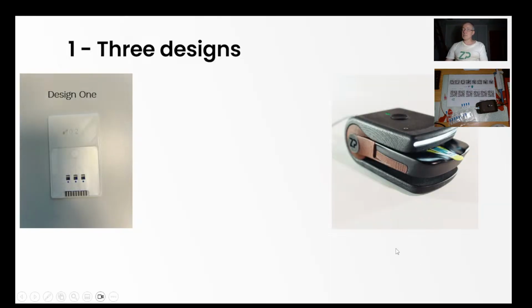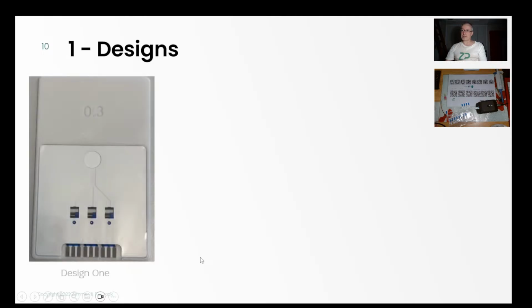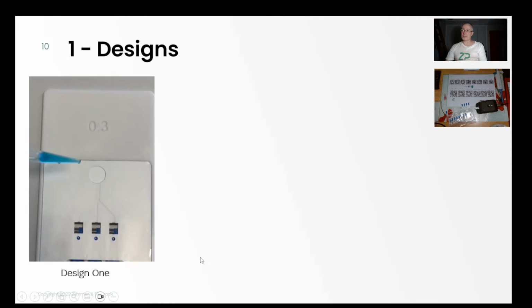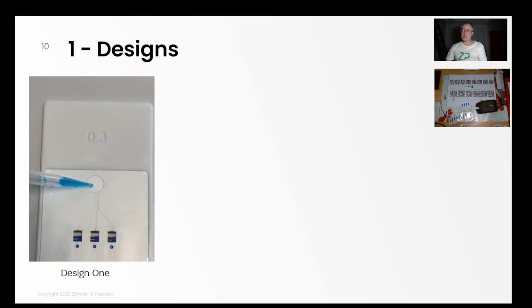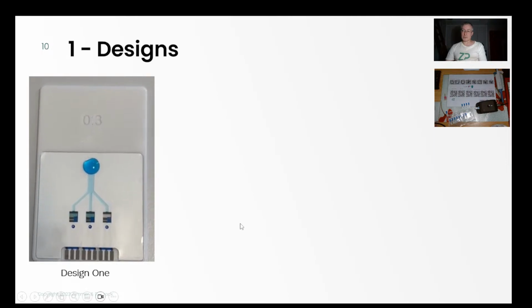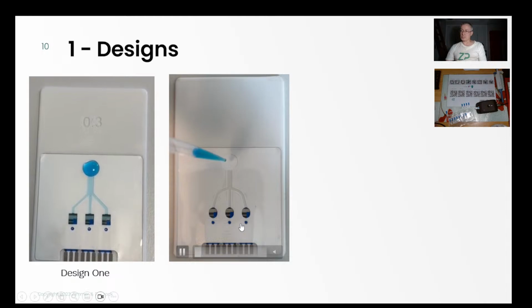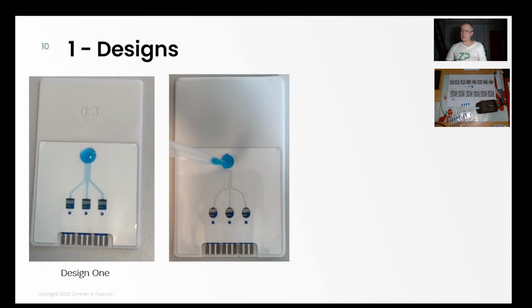It's probably worth saying at ZP, we have a lot of experience of not just doing single tests at a time. We actually have clients where we're doing parallel testing. You have a drop of blood, probably 50 to 100 microliters, and here we're doing 3 tests in parallel, in different configurations. You can see the way it's capillary filling.